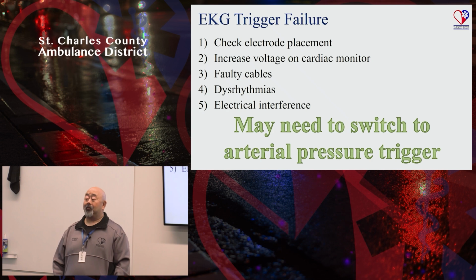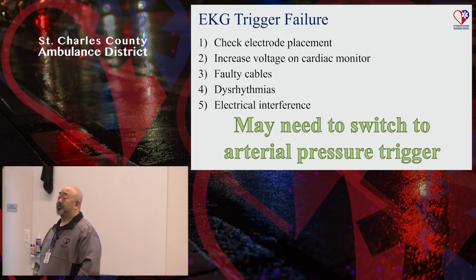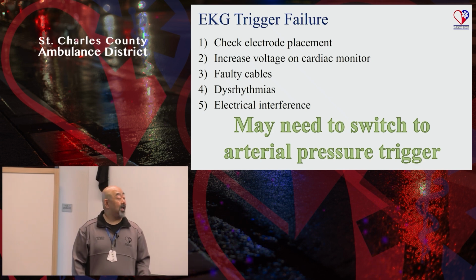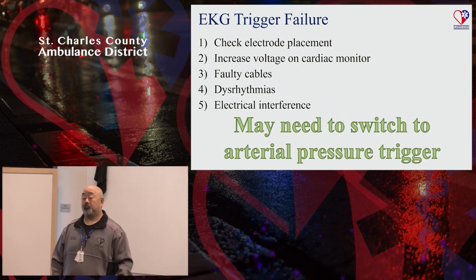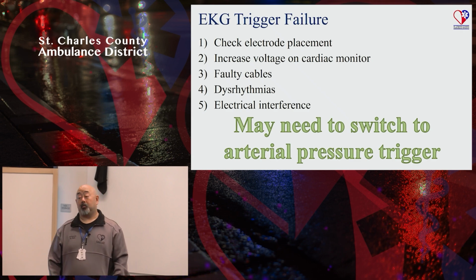I honestly haven't seen that very often. Fiber optic now, right? I don't know, actually. I'm pretty sure the ones we have, if you take the electrodes off, they'll switch to fiber optic, which is essentially a pressure, but it's going off of the light, so we don't hang a pressure bag anymore. It'll just do it. That's great. If that's going to be easier to do, maybe just do that. The point is, if you have an option, use that option.